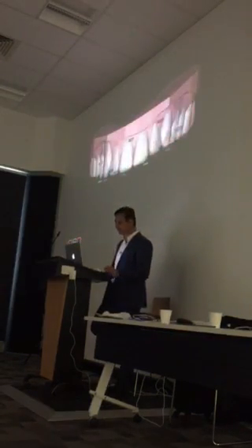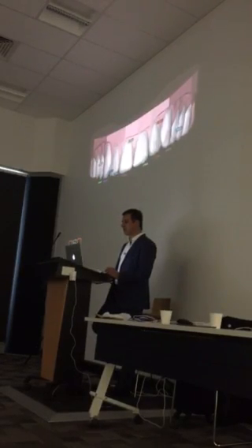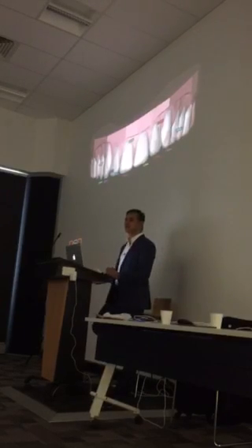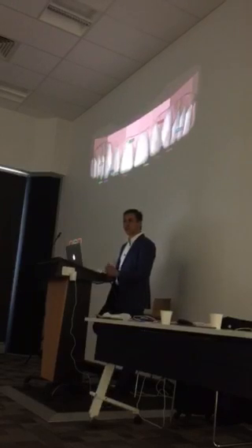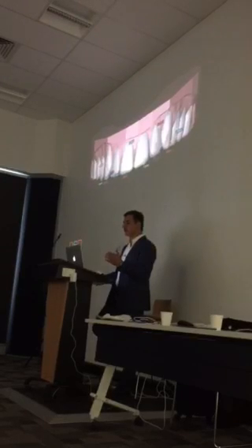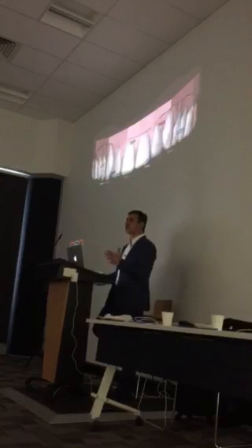or this is suggested. So you can see the gingival difference in the heights of the 1-3 and the 2-3, but aesthetically this is not going to be an issue. His lip, where his lip sits. It was more so the proportion, the curvature, where it sits in the arch. So the software is extremely accurate in terms of the amount of buccal contour, where it sits, so not only for gingival correction, but also for final milling of the restoration.